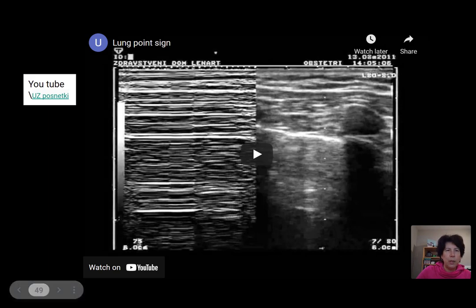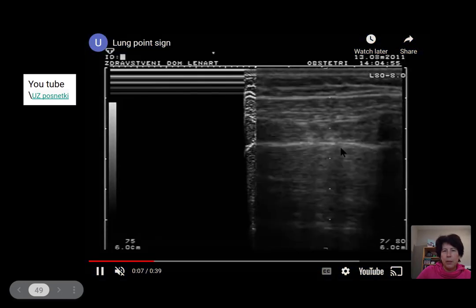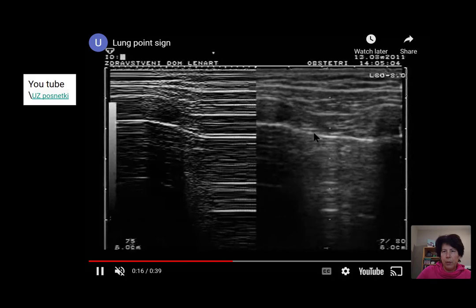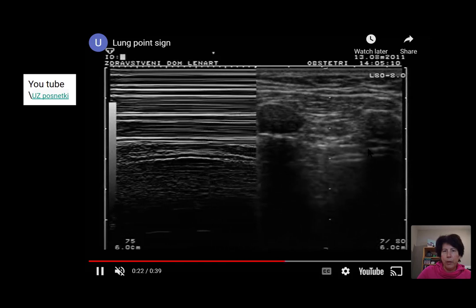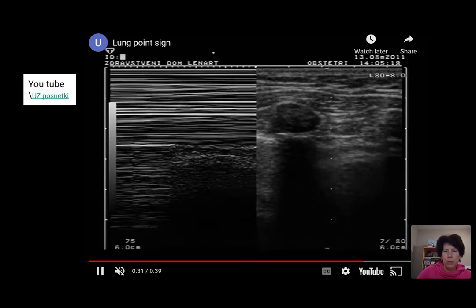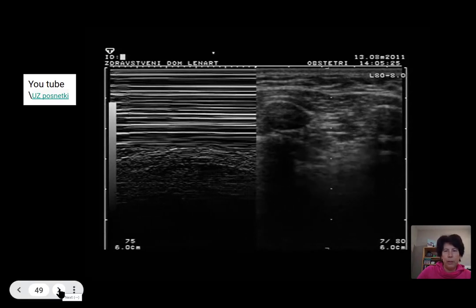And so this actually was a very good video that I found from this guy, Posnetki. So we're going to look at this. So first look on this side of the screen. So he's looking for his ribs. So finding the ribs. Now looking at the pleura. Pleura is not moving, following it out. And here we now see moving. So now if you look at the M-mode, you're going to see barcode, normal, barcode, normal, barcode, normal. And that is what a lung point looks like.